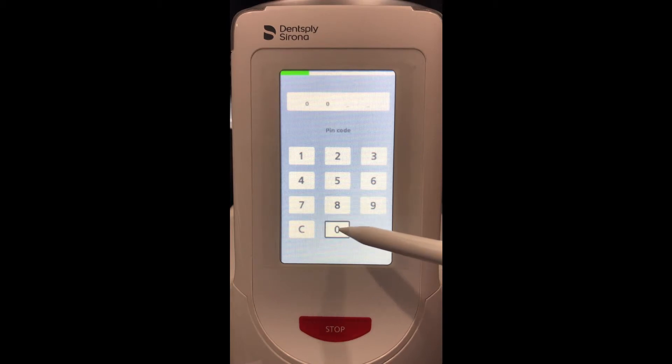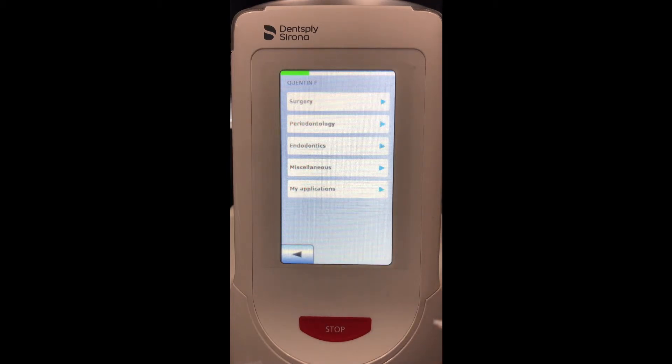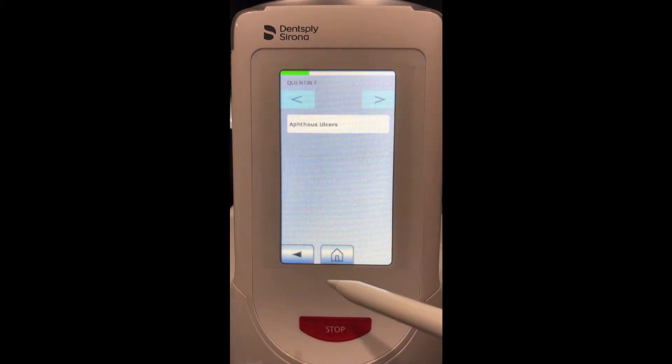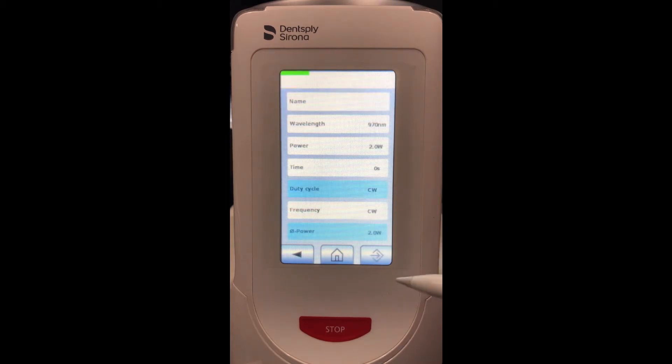Back on the home screen you will see six procedures — these are my six favorites added to the home screen. If I click the tooth in the middle, this will take me to a list of procedures that were pre-programmed into the laser: surgery has soft tissue surgery, endo for pulpotomy or a root canal, miscellaneous for abscess and ulcers, low-level light therapy, and then my applications where I can create custom procedures.